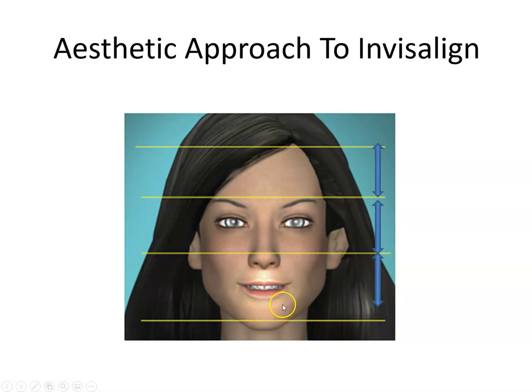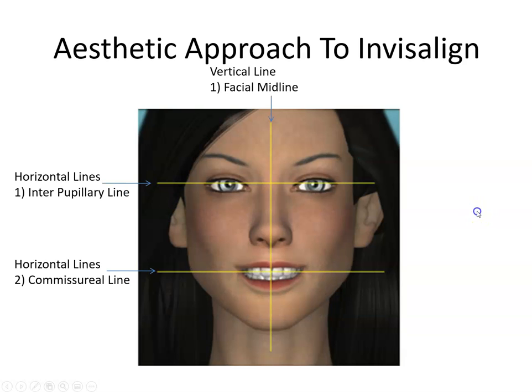Now, this is a very advanced concept. It's not for this training. This is just more for you to understand that the thirds play a very important role in designing an Invisalign case, and you should always consider both the bone health, the gum health, and the teeth positions, whether they could be brought in or not.